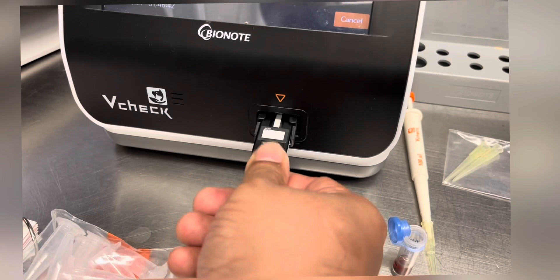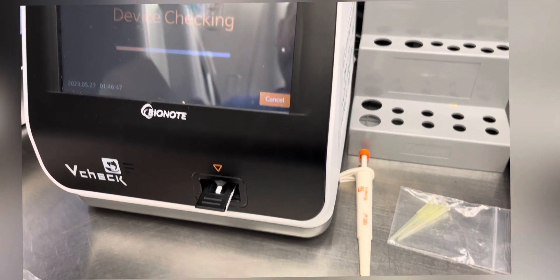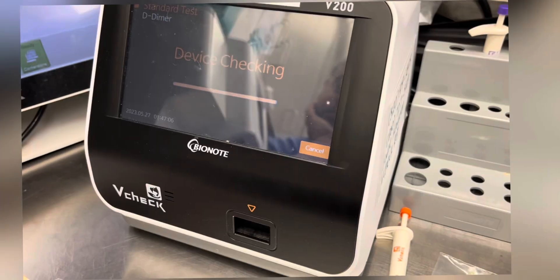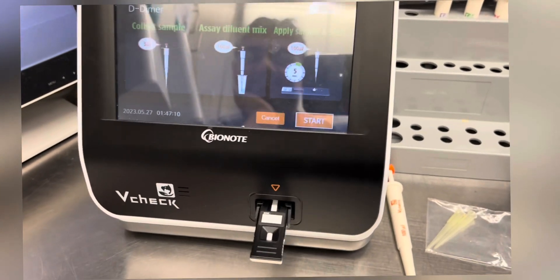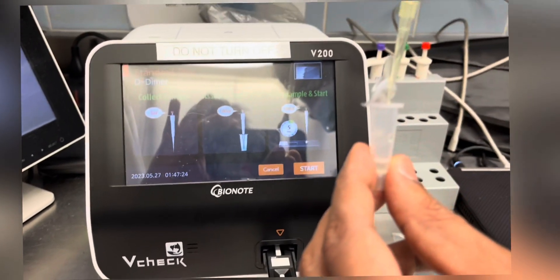The machine will take some time to read the cartridge. After this, we have to add the sample to the cartridge. After a few seconds the cartridge will come out and extend — at this moment we have to add the sample.